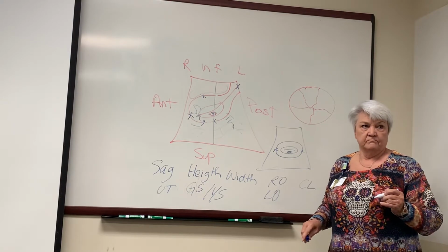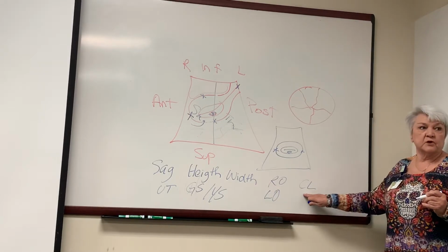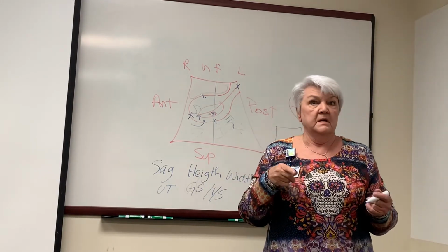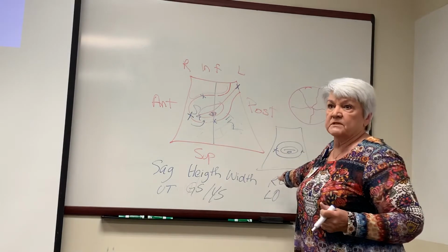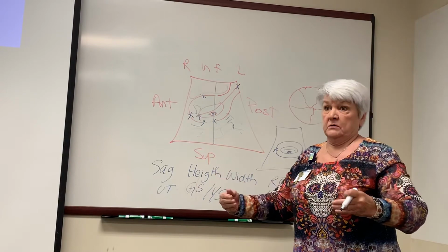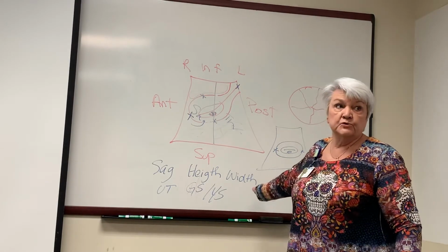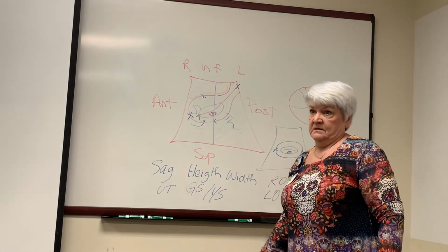Okay? Again, why are we measuring the corpus luteum? Because that's going to help us determine the gestational age of this. I didn't know that. Okay? Because if there's not a corpus luteum, what's going to happen? The baby will abort. Okay? Because what does the corpus luteum do? It acts as the placenta until the placenta takes over. So if I don't have a corpus luteum, then my embryo will fail to thrive. It's not getting any nutrients. It's not getting rid of the waste. Okay?